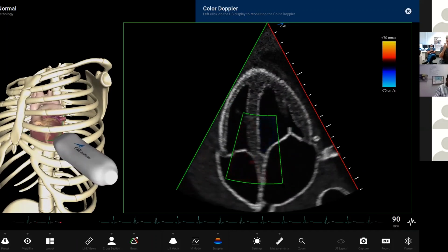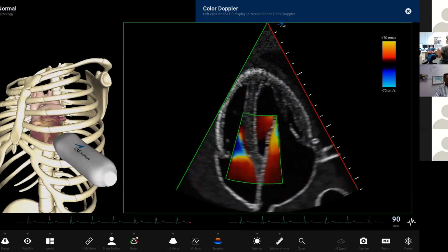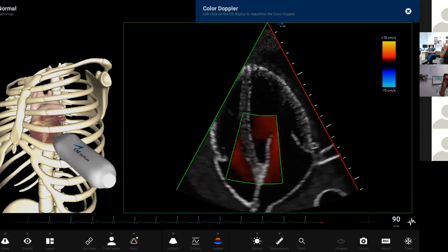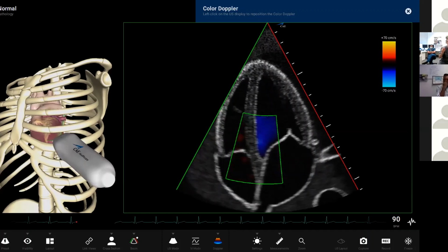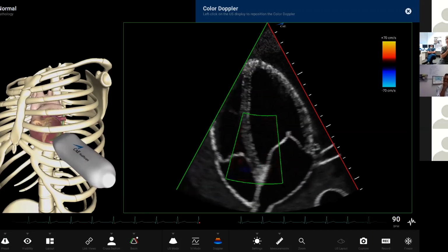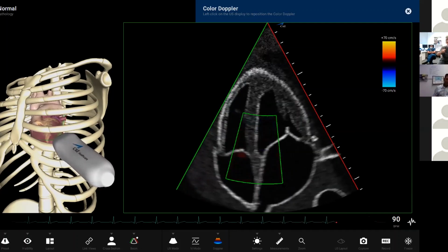After that, it's all about Doppler optimization. So when you've got your Doppler profile, you turn the gain down until you get only the brightest part of the Doppler signal. You're looking at what's known as the modal velocity. You want to ignore the fuzz, or what they call the beard and the chin. You want to find the chin, you don't want the beard. So that's why you turn the gain down and try to find the modal velocity. So find the chin, not the beard.